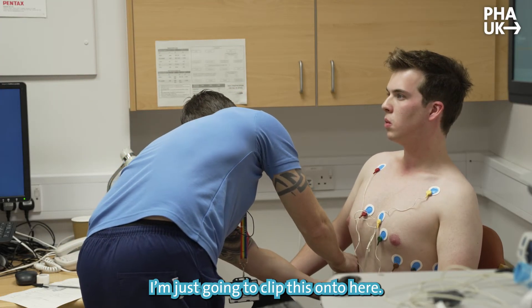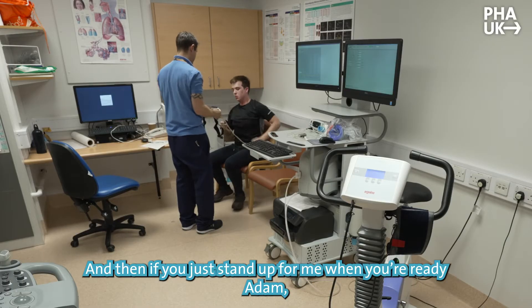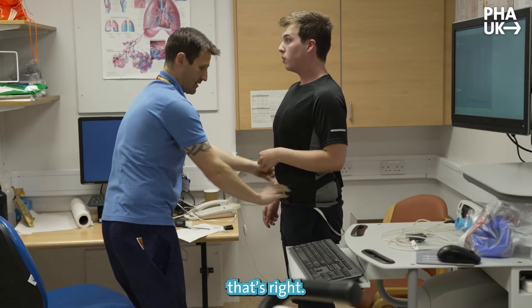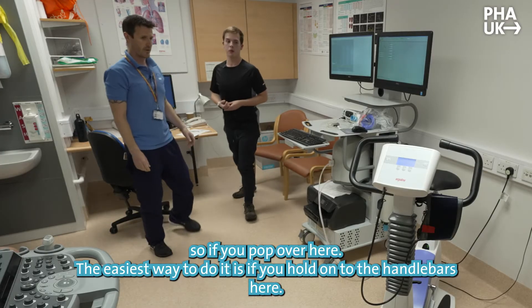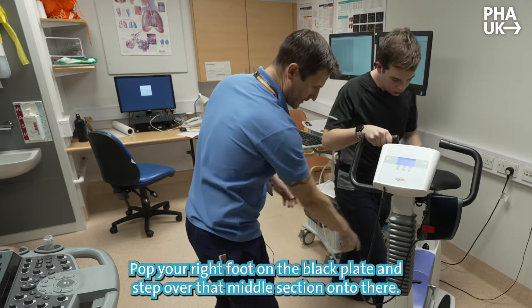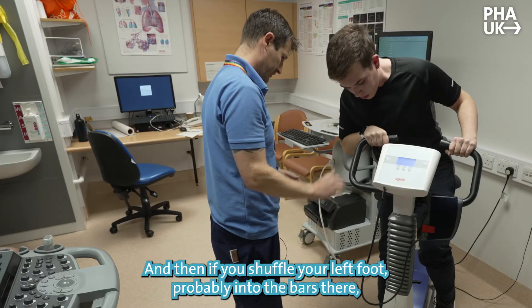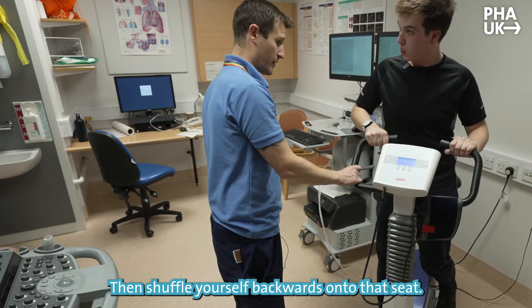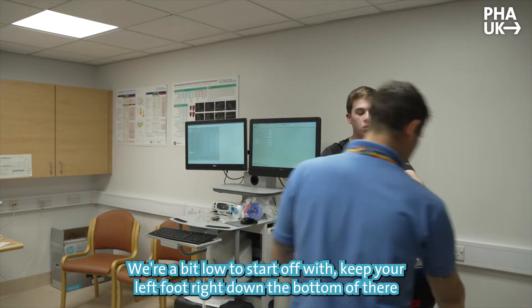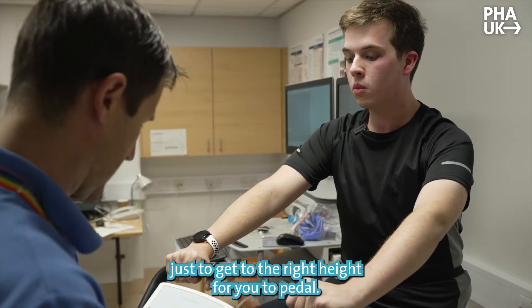I'm going to clip this onto here, and if you want you can pop your shirt back on. If you just stand up when you're ready Adam — so hands up, feel comfortable enough at that level. We're ready to put you on the bike. Easiest way is to hold onto the handlebars, pop your right foot just onto the black plate and step over that middle section. Then shuffle your left foot into the pedal. Jump yourself upwards and backwards onto that seat — you'll be a bit low to start off. Keep your left foot right down at the bottom and I'm just going to raise the seat up to the right height for you to pedal.